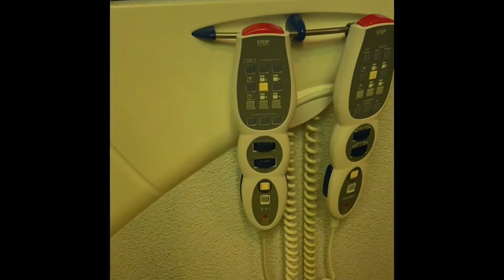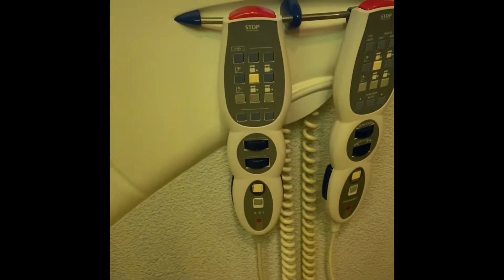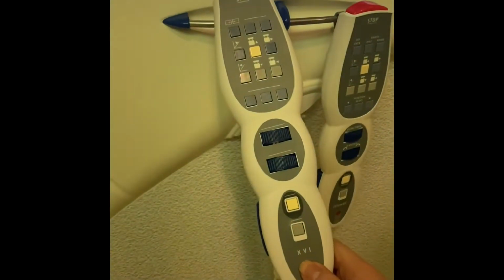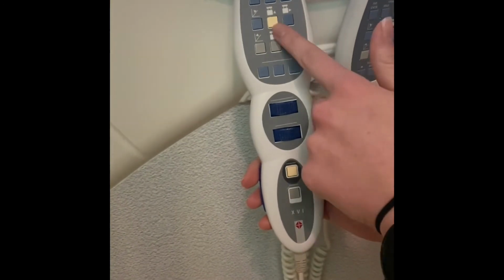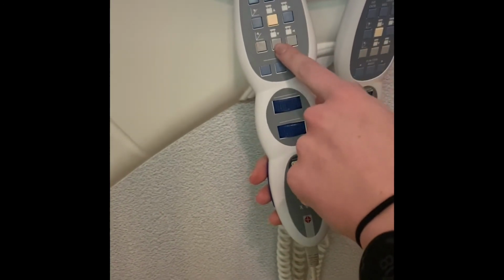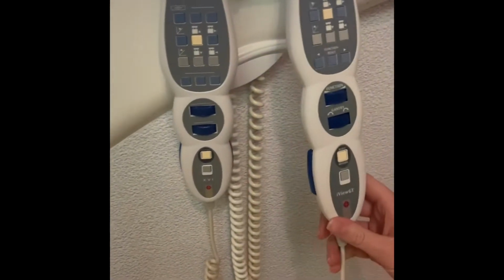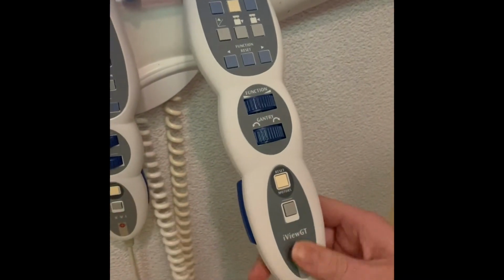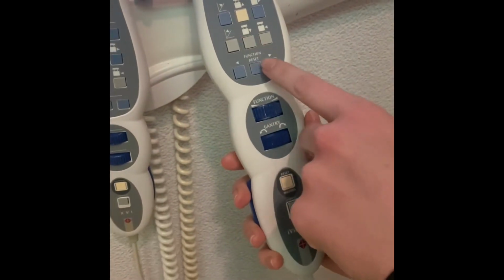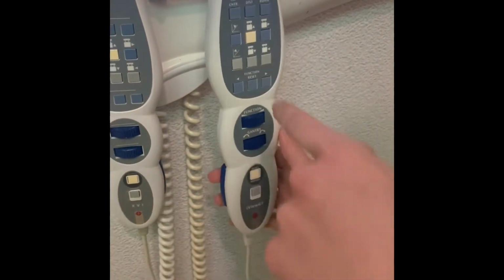So this is just going to be a very brief overview on some of our imaging technology that we have for our Elekta machines. We use XVI for our KV imager, and to do that, these are the main controls that you will use. So this is to move the panel outward, and this is to move the panel inward. For our MV imaging, we use iView, so this is the remote that you will use, and you will use the same functions on this one. This is to move the panel outward, and this will be to move it inward.